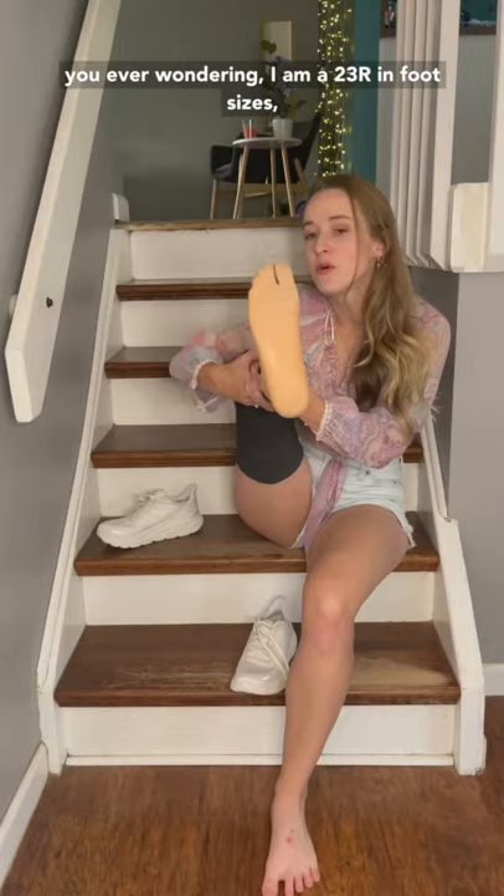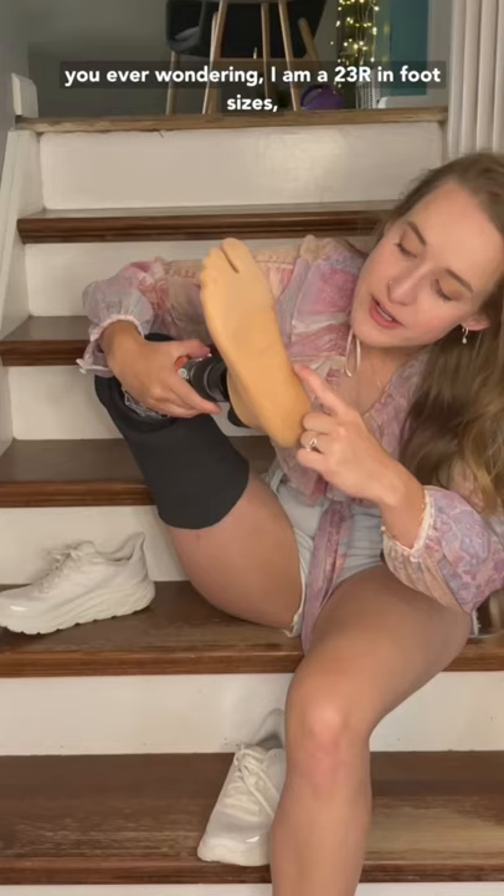In case you're ever wondering, I am a 23R in foot sizes, which is like a seven and a half in women's. And that, my friends, is everything I know about prosthetic feet and shoe size.